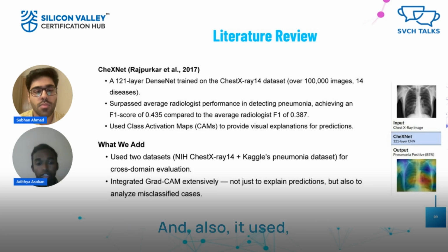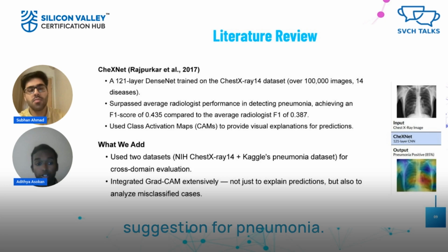And it also used class activation maps to provide a visual explanation for predictions. As you can see here, this is an example of Grad-CAM, which highlights the region where it suggests pneumonia has been detected. The redder regions suggest a stronger indication of pneumonia.